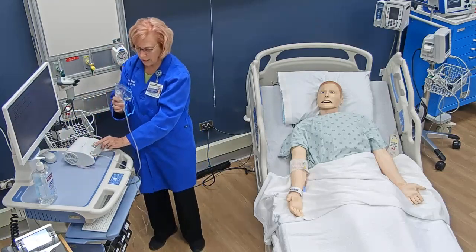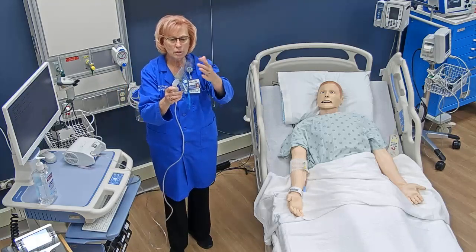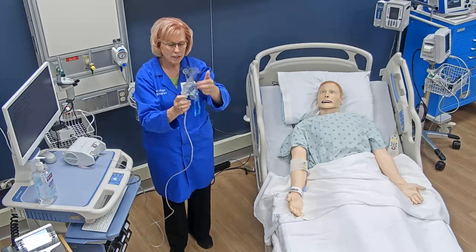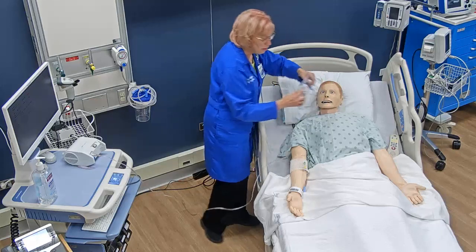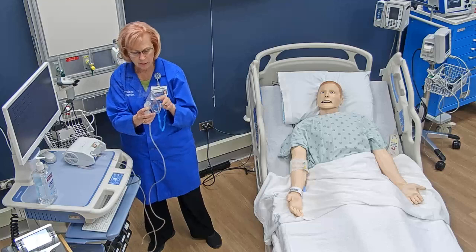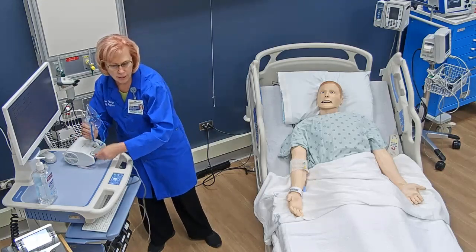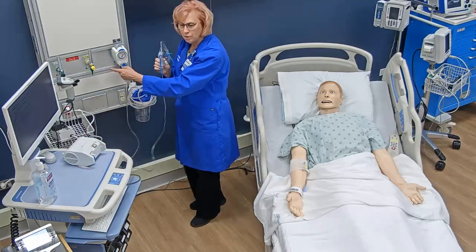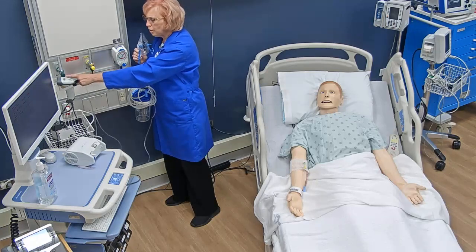and you turn the machine on. As soon as you see the medicine, the fog basically of the medicine, then it is ready for you to put onto your patient's face. So this is one option for giving the nebulized medication, is to use this machine. In the hospital, they usually do not have these machines, so instead they hook it up right to the oxygen flow meter. Remember, your oxygen flow meter is always green.